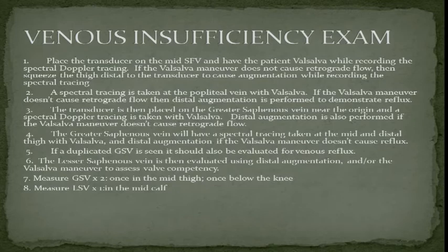So if the patient has done the Valsalva maneuver, you have stopped the amount of blood going into the IVC. Automatically, that incompetent valve will kick in and blood will start going to the superficial femoral vein in the opposite direction. At that time, if you have documented it, you are done. But if you cannot document with Valsalva, you have to do distal augmentation.